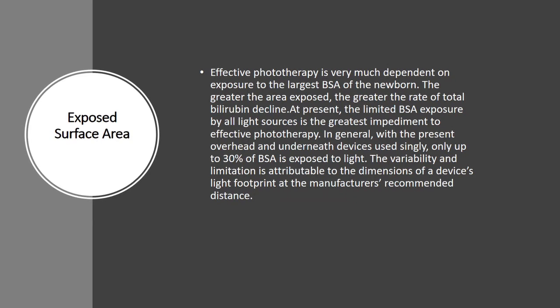Exposed surface area. Effective phototherapy is very much dependent on exposure of the largest BSA of the newborn. The greater the area exposed, the greater the rate of total bilirubin decline. At present, the limited BSA exposure by all light sources is the greatest impediment to effective phototherapy.